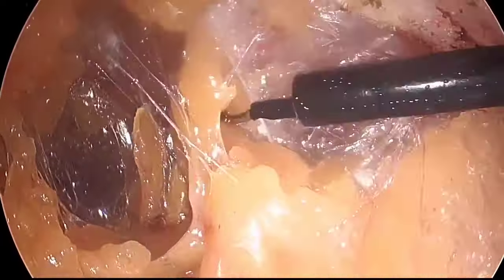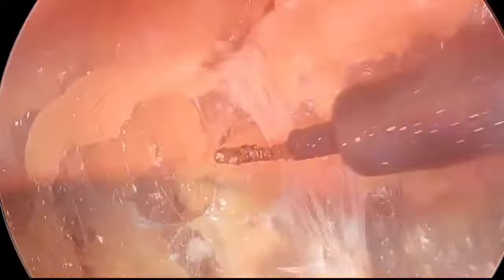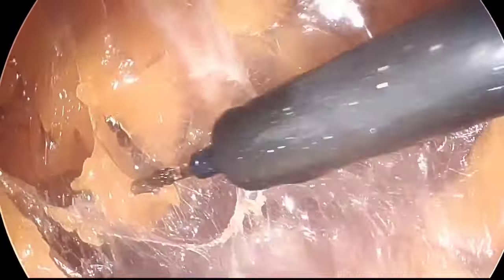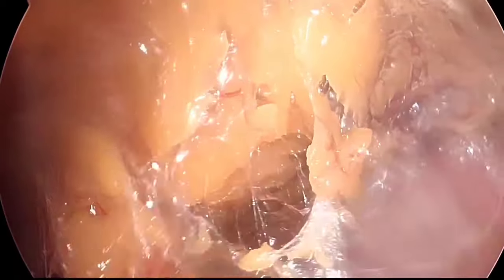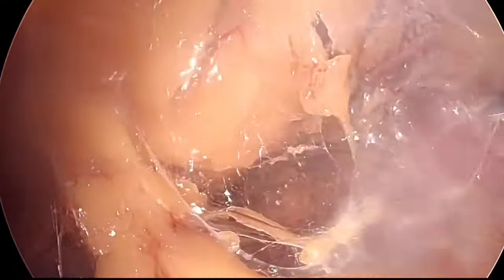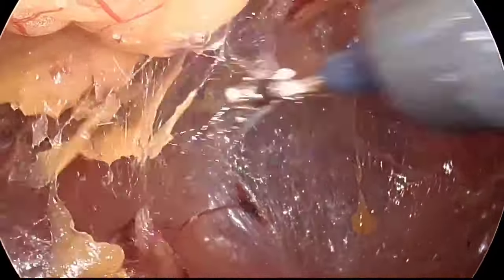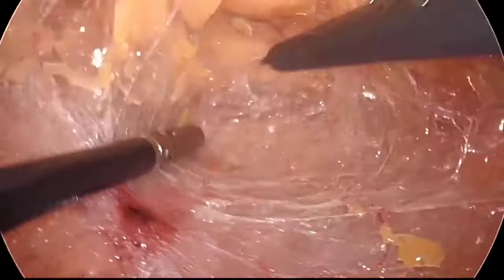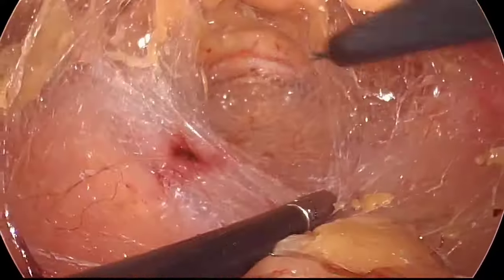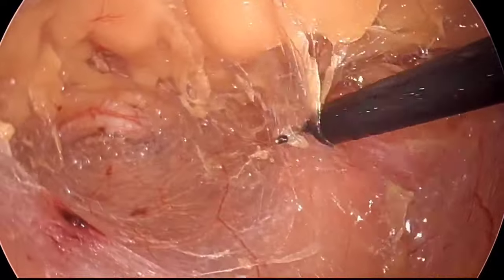So you can see the posterior aspect of the right posterior rectus sheath and the arcuate line here, and then lower down I have created further space gradually, safeguarding the inferior epigastric vessels. So these are the midline fats, preperitoneal fats that were brought down, and I have kept one more port, maintaining the triangulation in the laparoscopic technique, at the level of the umbilicus. So this is the midline, and you can see we have exposed the pubic arch.